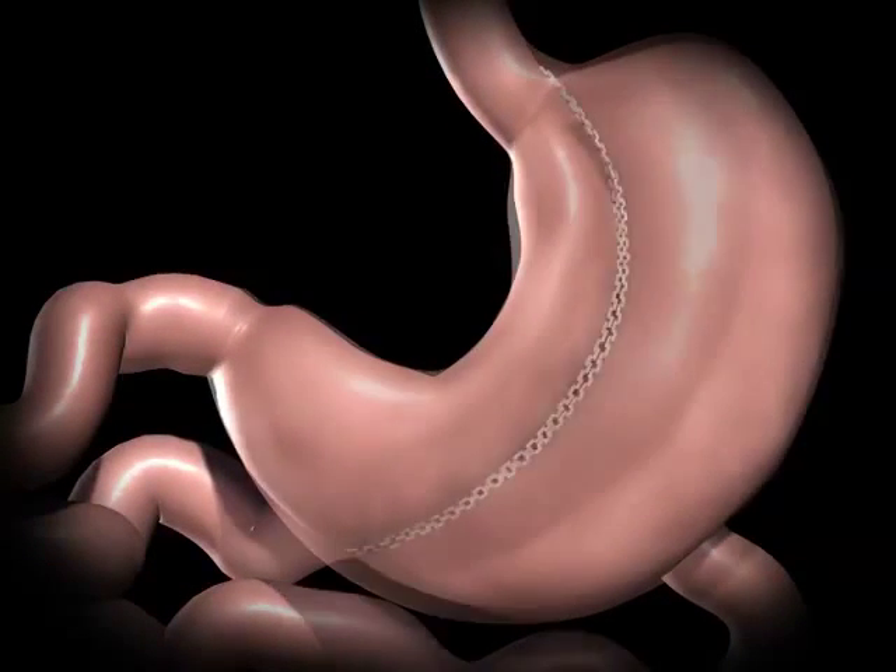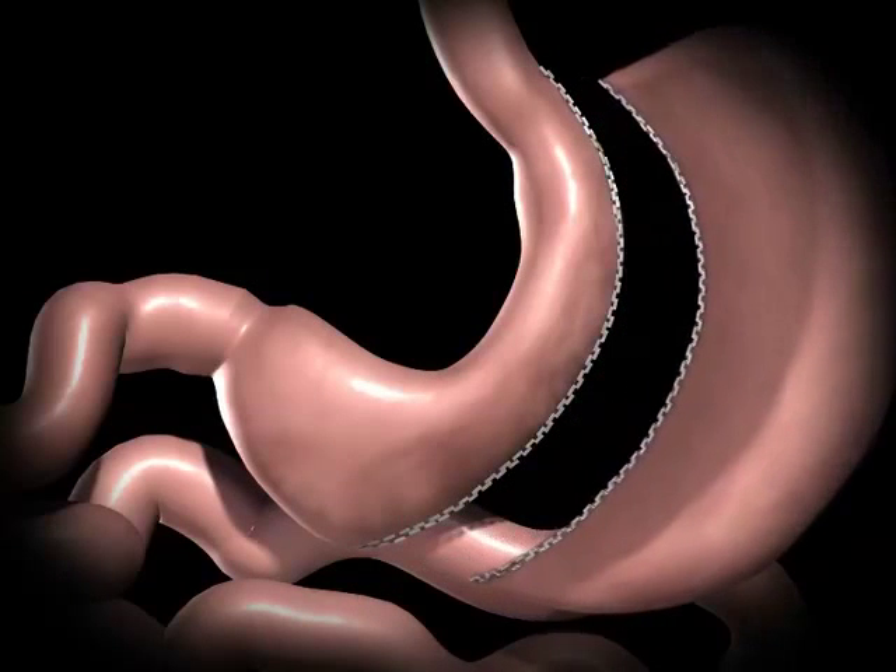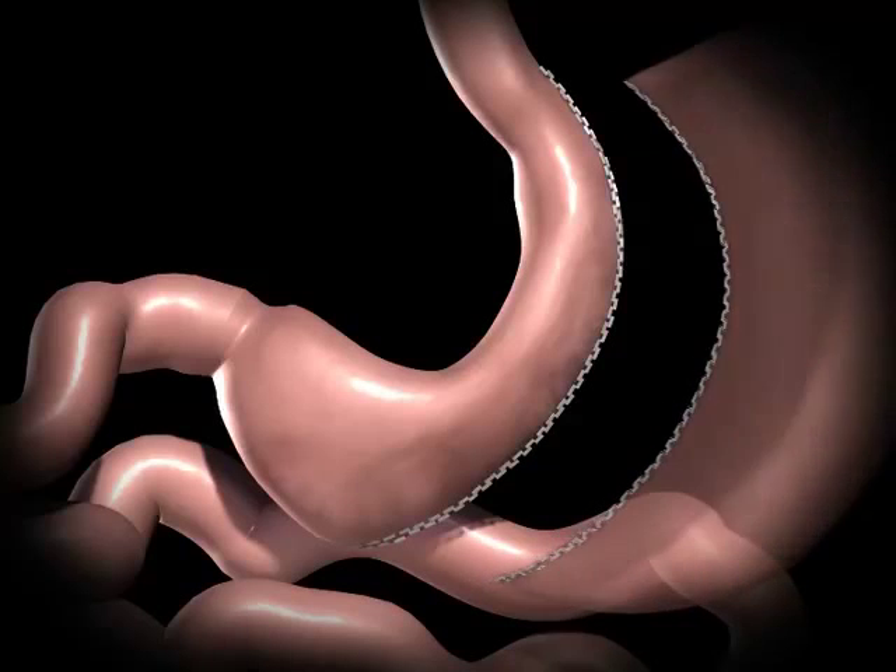During a sleeve gastrectomy, a thin, vertical sleeve is created by using a stapling device. This sleeve will typically hold between 50 and 150 milliliters, or is about the size of a banana. The excised portion of the stomach is removed.